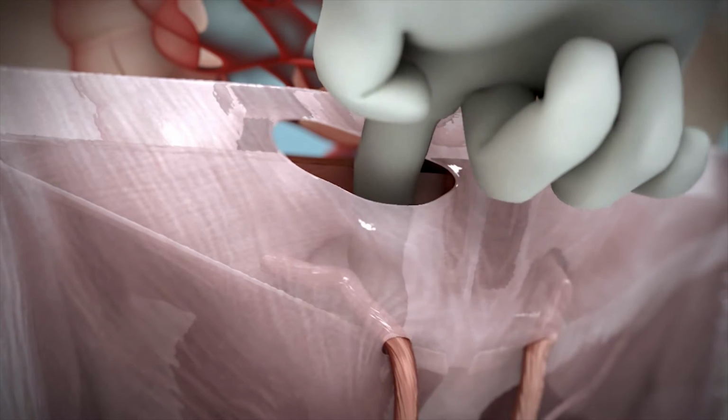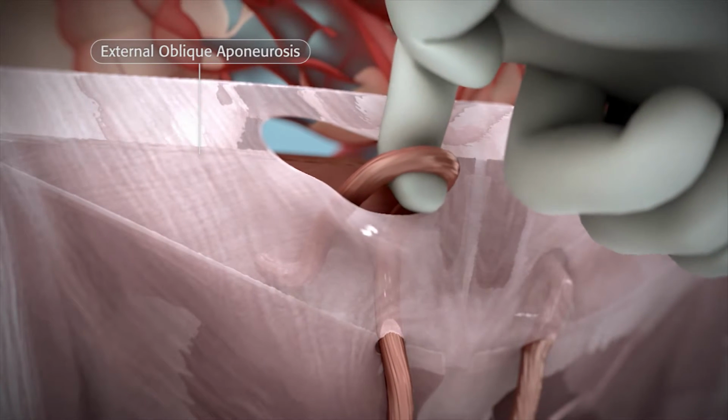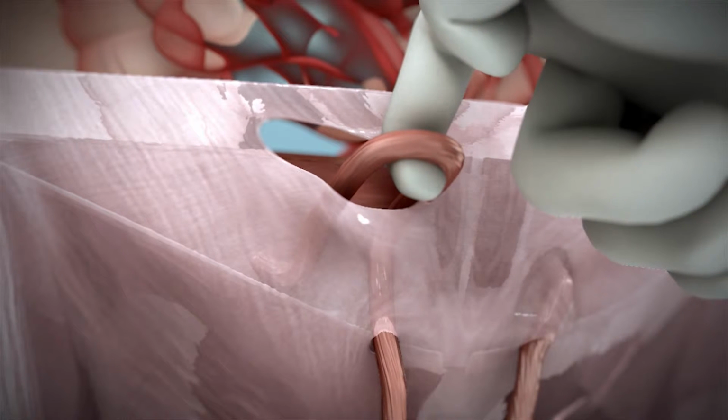Identify and mobilize the spermatic cord from the posterior wall of the external oblique aponeurosis. Elevate the cord up and out of the incision site and isolate with a surgical loop.